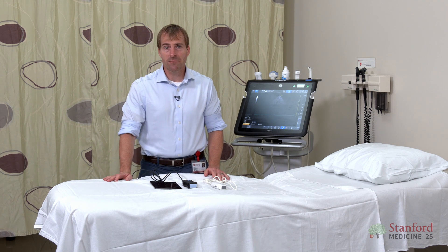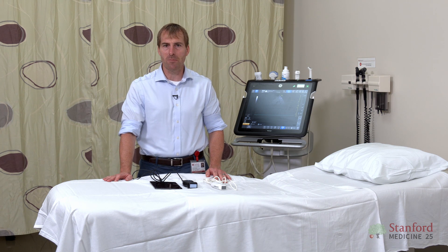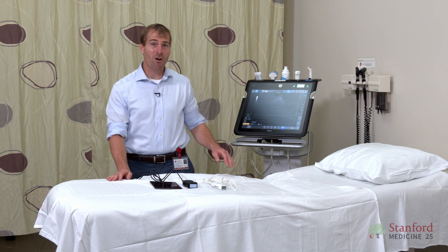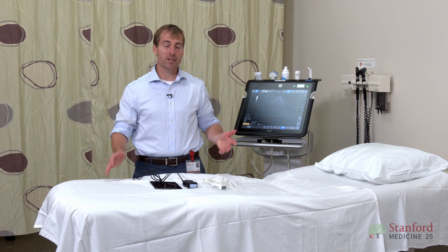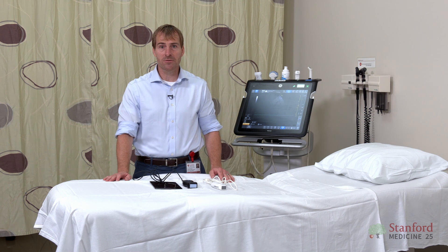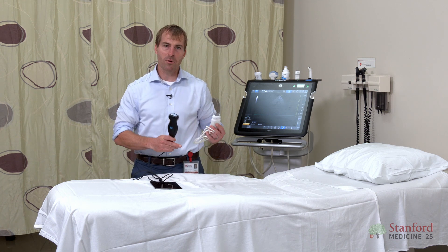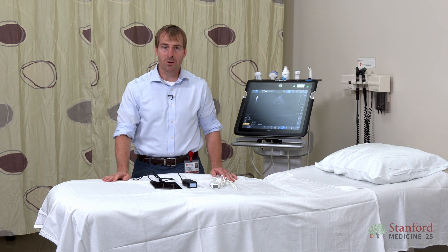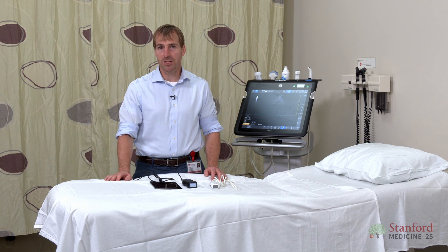Next, you need to think about price. The price of ultrasound machines, a little bit like buying a mattress, it can be hard to know exactly how much they cost. Machines like this you have to get from a medical distributor and it's actually pretty hard to find out exactly what the price is. Larger cart-based machines are usually in the tens of thousands of dollars, whereas smaller pocket-based machines are going to be well under $10,000 and some for as little as two thousand. So when you're thinking about your budget, you really want to take that into consideration.